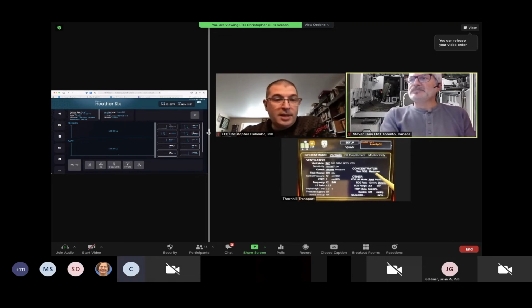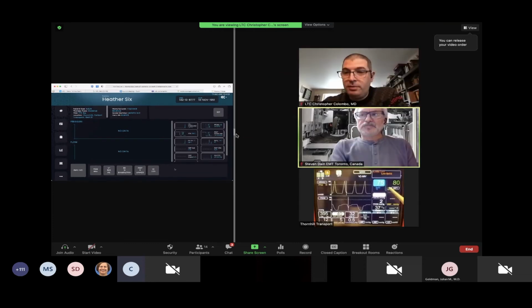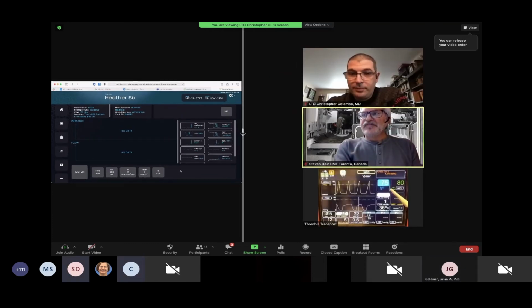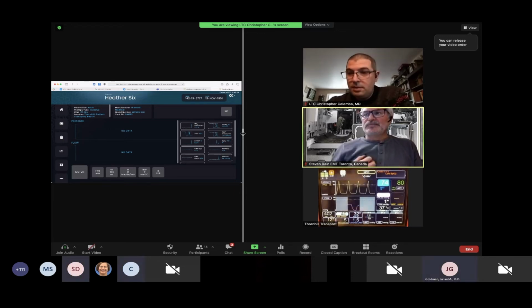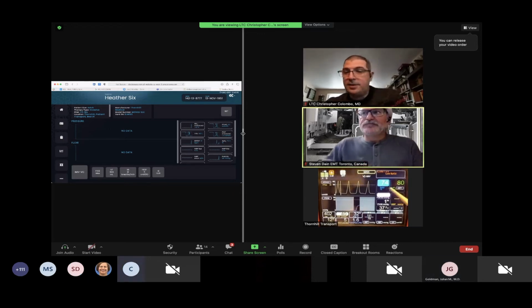Okay, so that may take a minute, but we'll just watch those stats with you. I'm putting the camera back on the vent. I see 75%. We may have to readjust that probe. Is it in a good place? Yep. Okay, good. So if that's reading accurately, that's not responding fast enough.